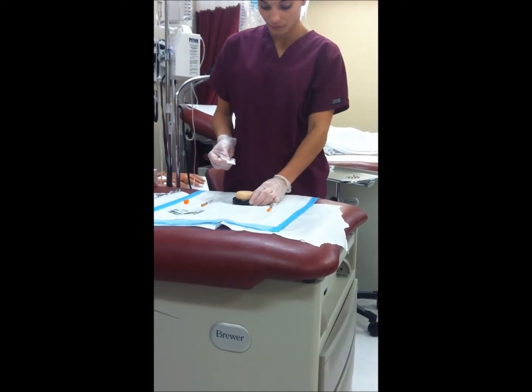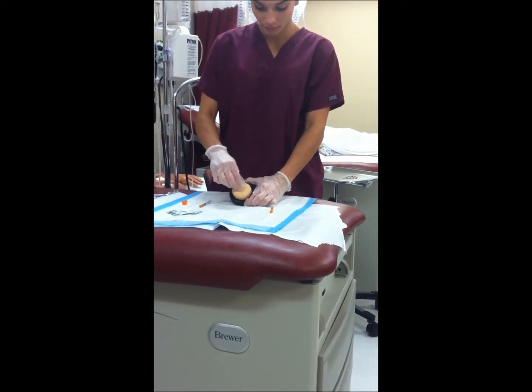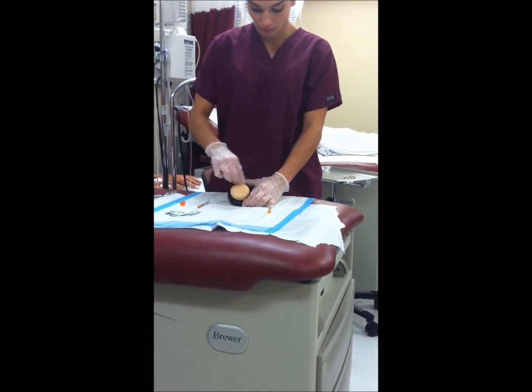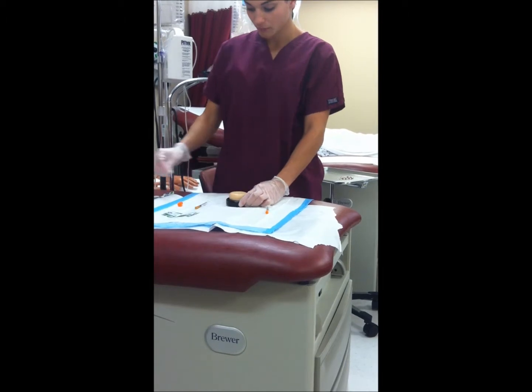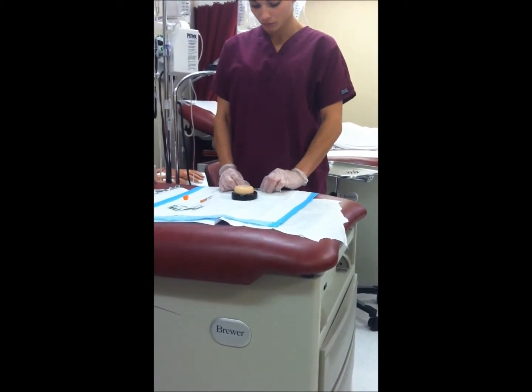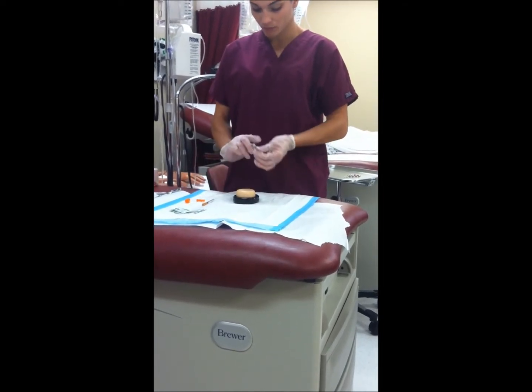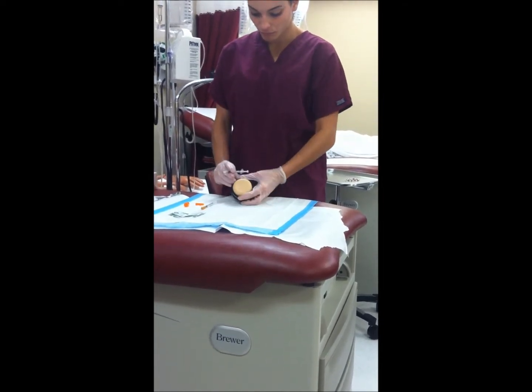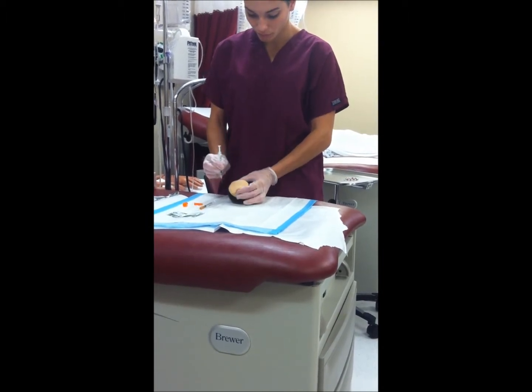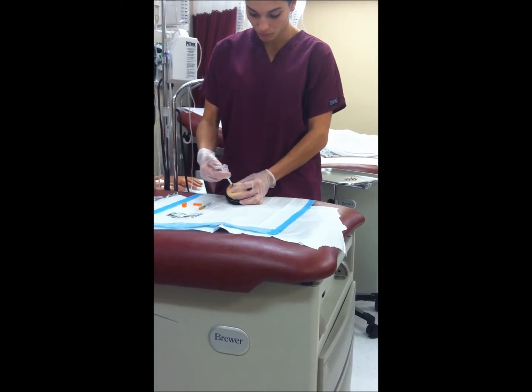When administering a subcutaneous injection, cleanse the skin with an antiseptic wipe using a circular motion, beginning with the center of the site and moving outward. Allow the site to dry before administering the injection. When giving the injection, it's important to lift the skin fold and puncture the skin at 90 degrees if the patient is of average size or obese. If the patient is a thin, malnourished adult, give the injection at 45 degrees.